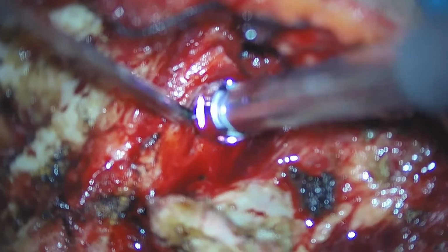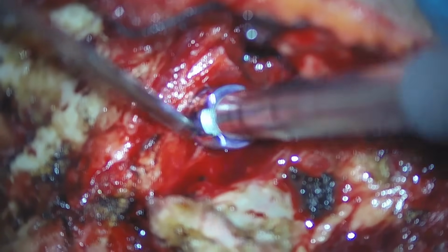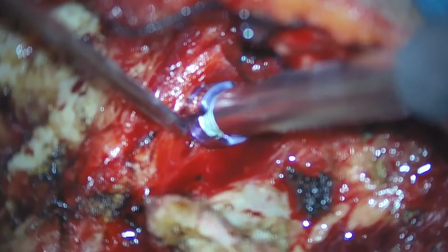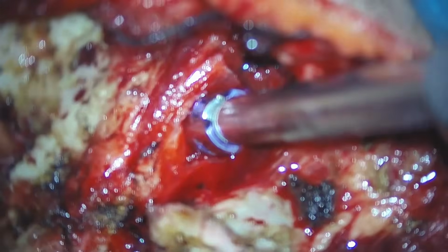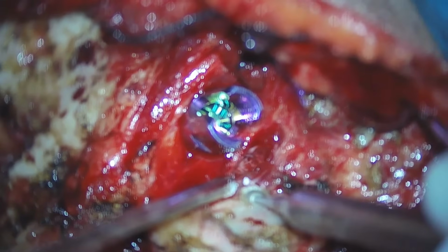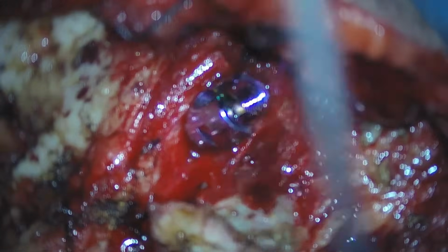Now we are placing the C1 lateral mass screw. This is a 24 screw, and it is placed slowly in the direction which is around 5 to 10 degree medial angulation, and should be directed towards the anterior tubercle. Next we are placing the C2 pedicle screw.